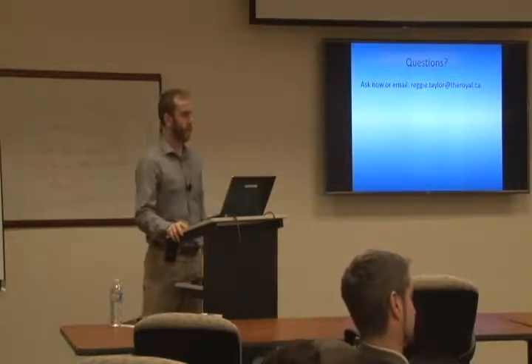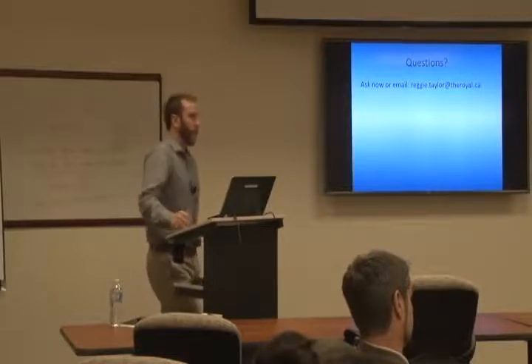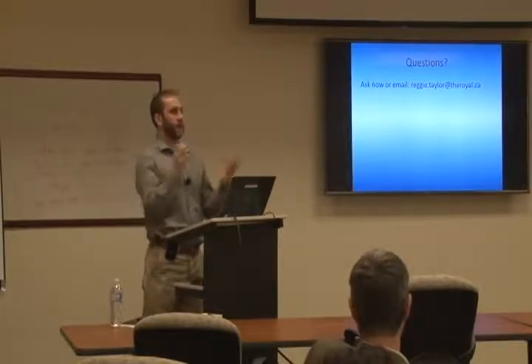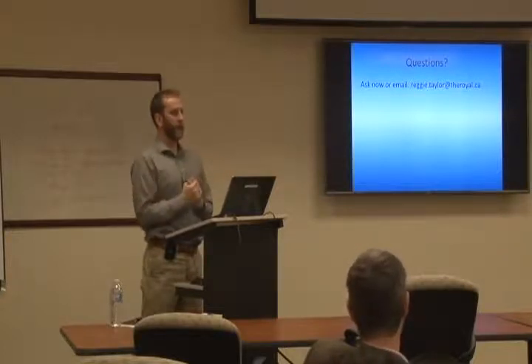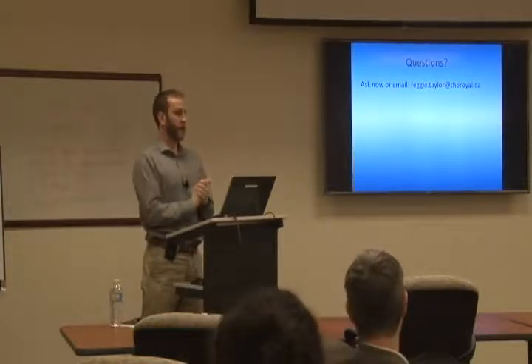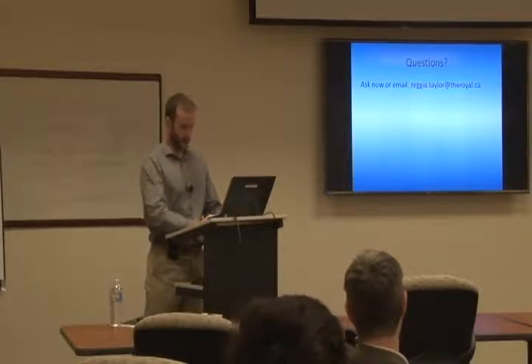On your 7T images that you worked on before, it seems that you were easily separating glutamine and glutamate. Can we do that here as well? Not as much, no. It's kind of like a law of physics, right? The higher field strength you go, the more separation you're going to have between the two. And as you get a lower field strength, they're going to come together a lot more.